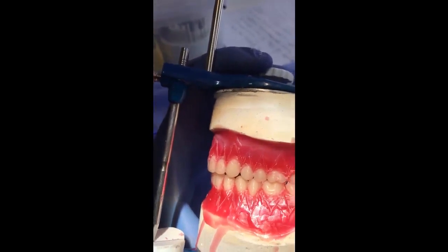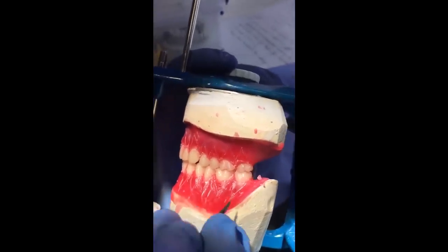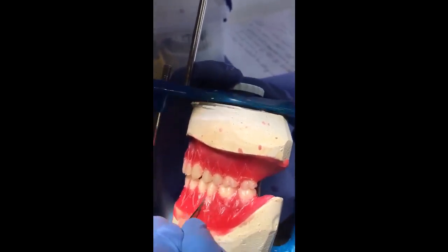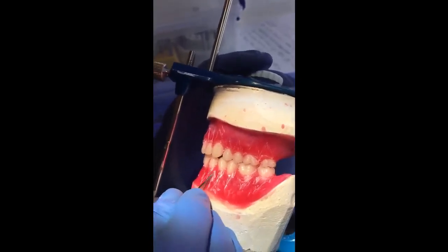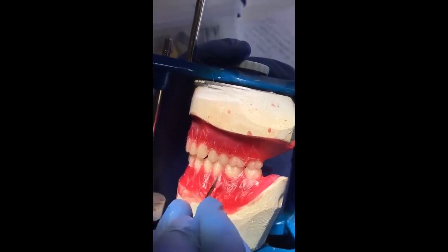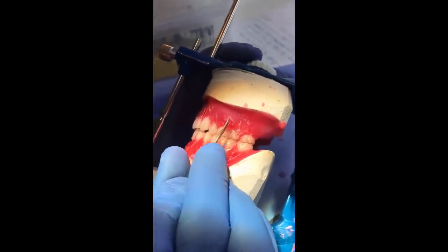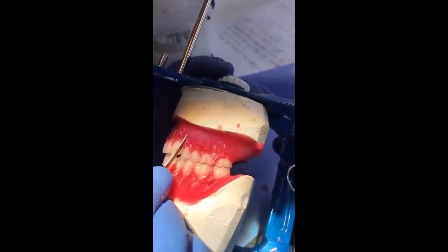Now we carve the wax between the triangles. We remove the wax from between the triangles and keep the wax in the area of the triangles, and this will create a prominence of the roots, as you can see, and this is important to distract the light and prevent the reflection of the light in straight direction, so the denture base will not look artificial.